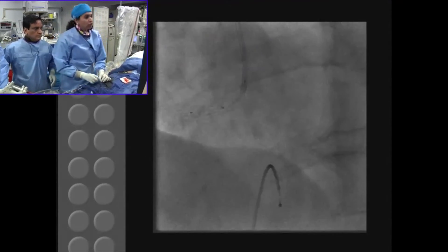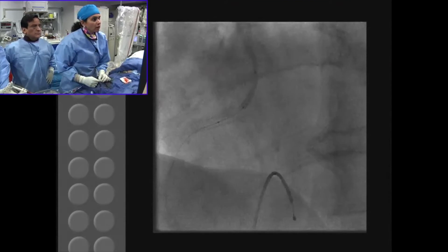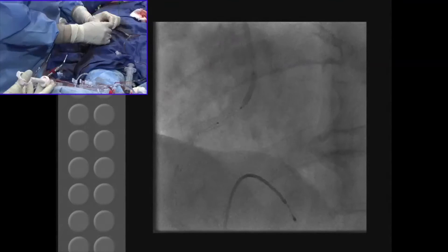There you go. The mid marker is actually inside the stent, so I pull back. There you go — right at the ostium, at the proximal. That's at the ostium of the stent.